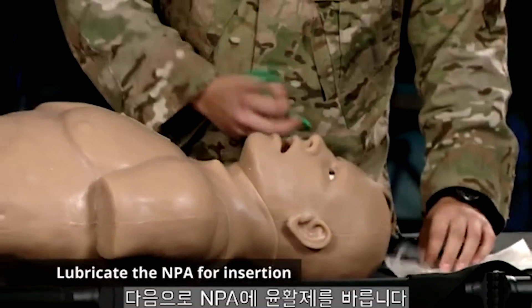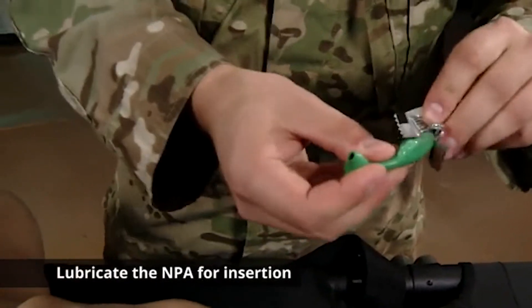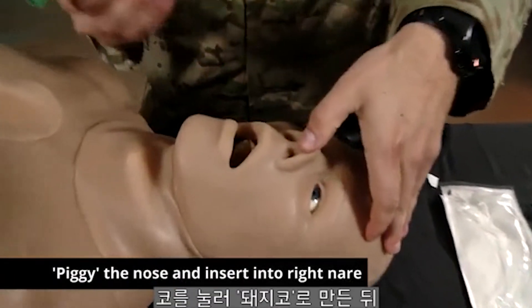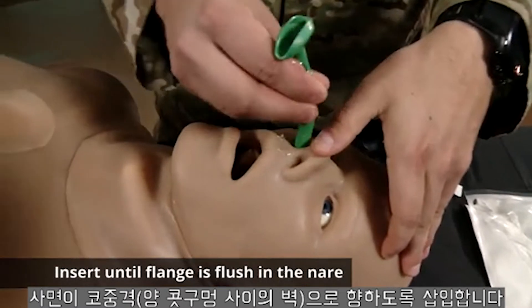The next step is you are going to lube the NPA. Taking the patient's right nare, we are going to tilt the nose, placing the bevel towards the septum and inserting.